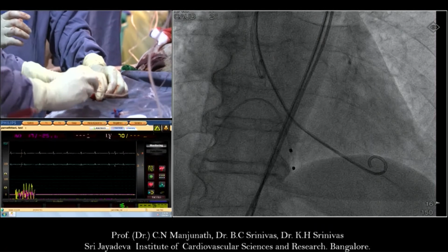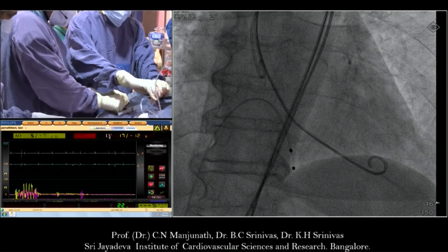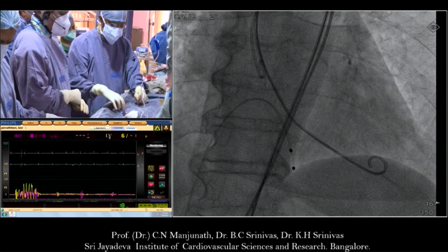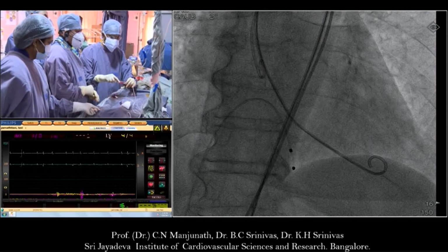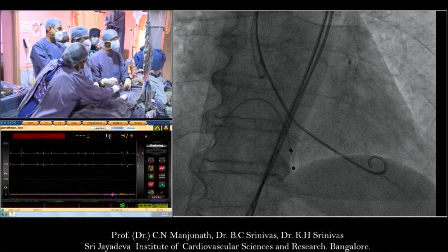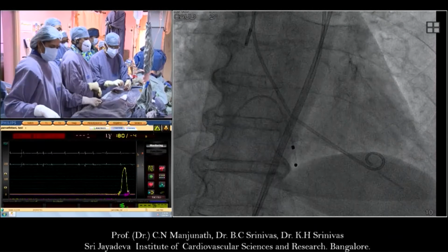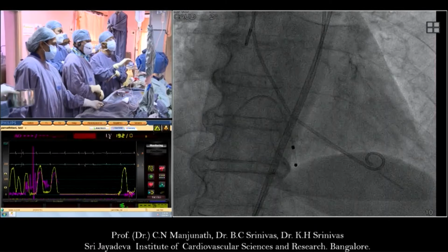We'll take LV pressure simultaneously. That's a really good sheath. It definitely doesn't have a groove like the E sheath does, and it just expands and collapses. I really like that sheath a lot. Yeah, it's like the old Solopath sheath. Remember that? But Merril have given a very good name, Python.